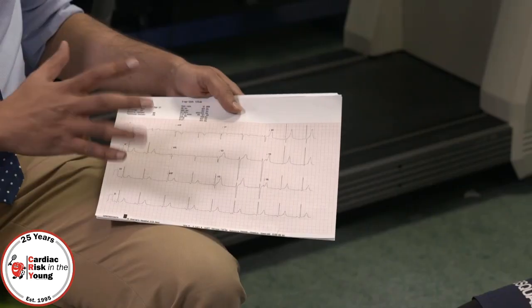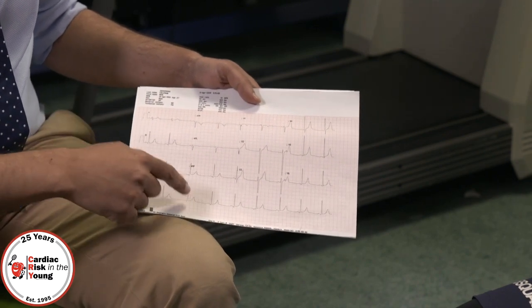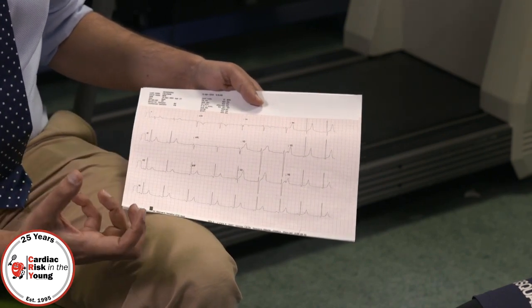We've hooked you up to the ECG machine so we could see exactly what the rate and rhythm is doing. I'm pleased to tell you that your ECG looks great. This is the electrical tracing of the heart — each of these beats represents a heartbeat, and I'm pleased to say that this looks entirely normal. Brilliant.